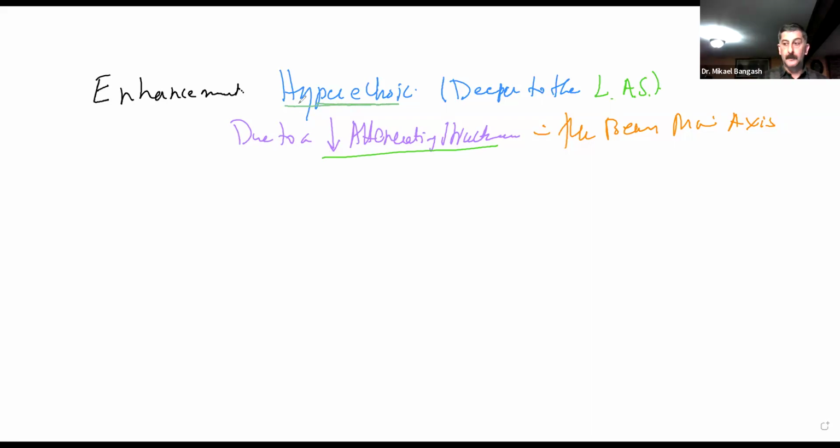If you look back at our assumptions that should be violated, we can say that the last assumption has been violated here: that the strength of the reflection is related to the characteristic of the tissue creating the reflection. That is not the case here. Here, the strength of the reflection is stronger than the reflection created by the tissue.